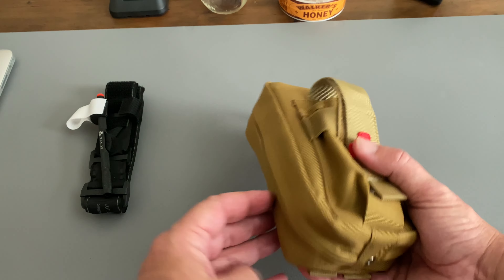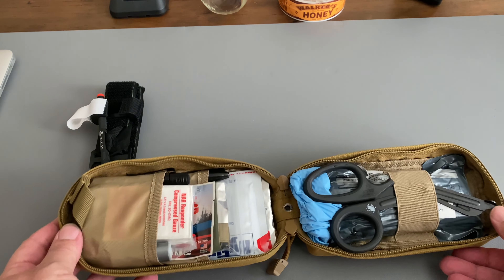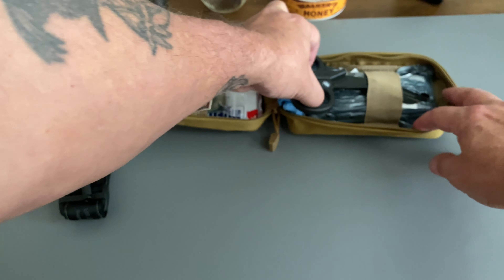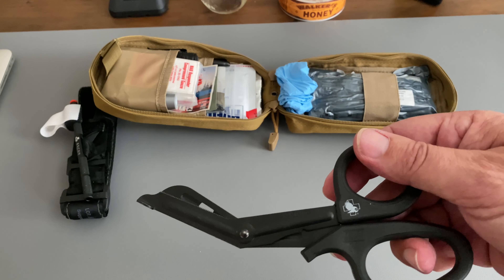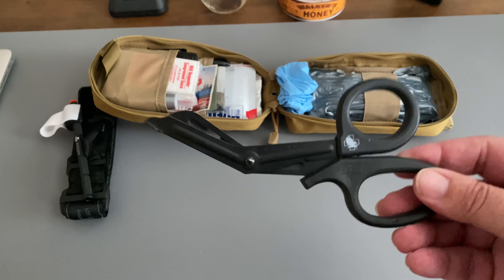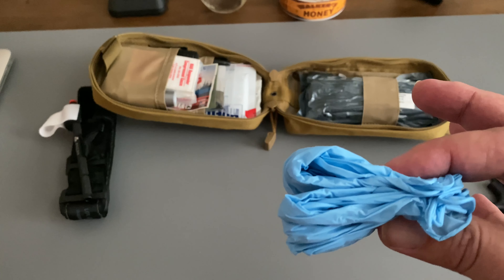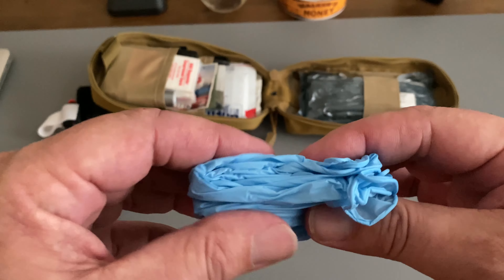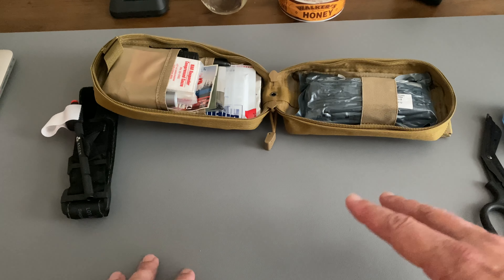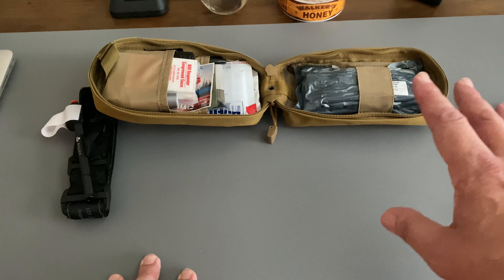On the inside here, what we have completely clamshells open — up here we have our trauma shears, a pretty good set from North American Rescue. I put in two pairs of blue gloves. Blue, not black, because when you're doing your sweep over the body, you want to be able to see the blood. With black gloves it's going to be harder to see blood, so I went with blue.